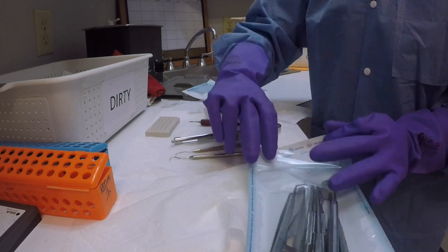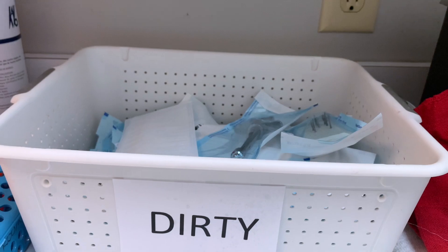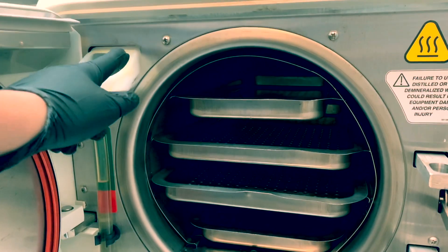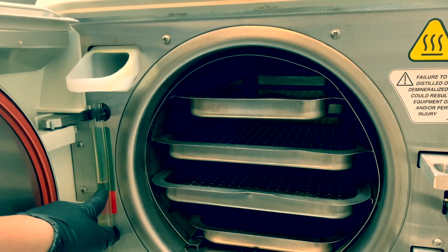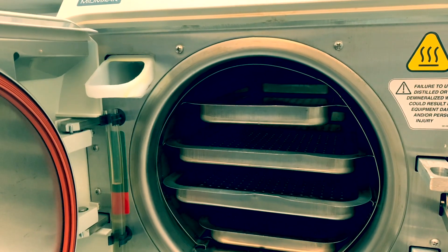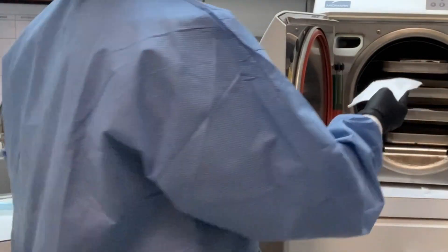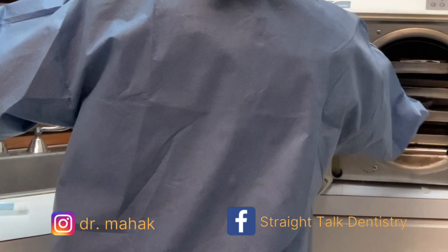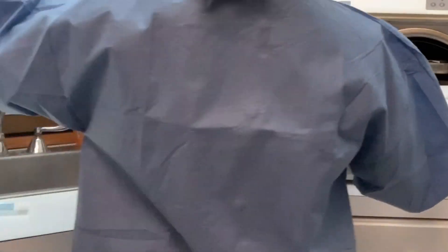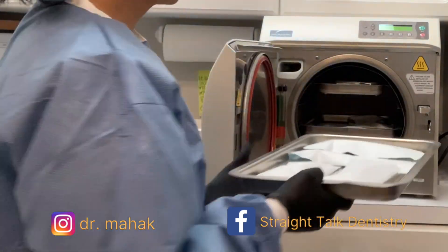Our bin seems full, so let's prepare our autoclave. The autoclave has an inlet for distilled water and a tube that indicates if the water level is sufficient — the water level should be in the green area. Now let's start loading our autoclave.